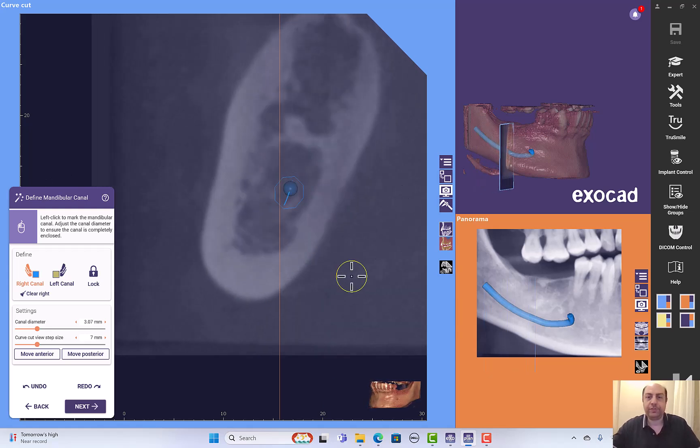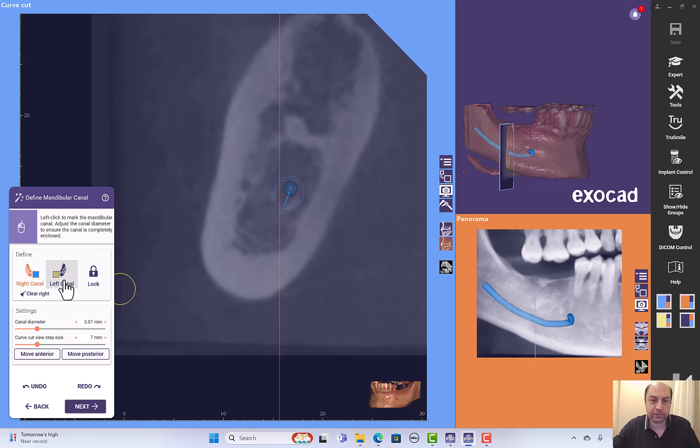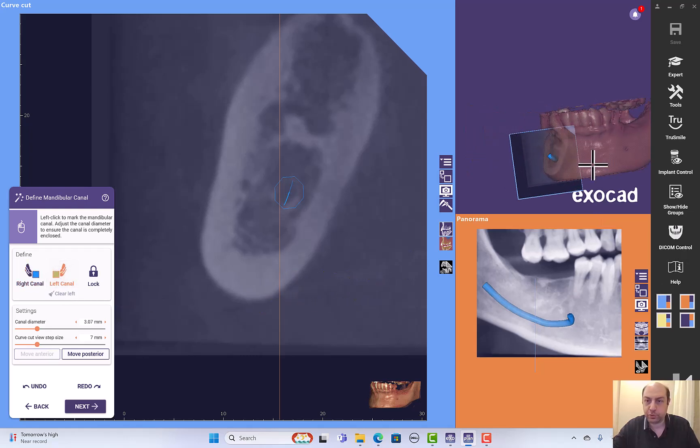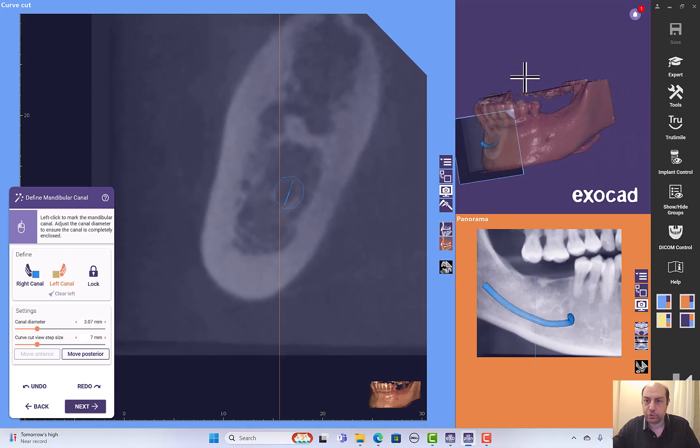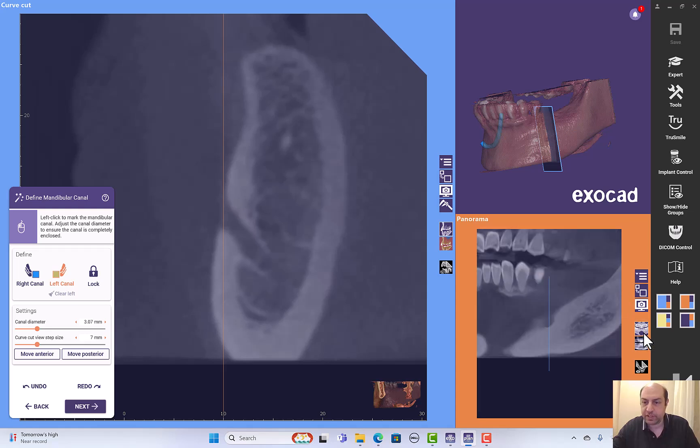Now we can switch to the left nerve. If you want to do the tracing on the panorama it's okay, but I prefer always to use the cross section. Let's do the left nerve. Let me show you how to do it on the panorama. First of all, we have to go to the other mental foramen and we make a small slice thickness of the panorama here and we can maximize.